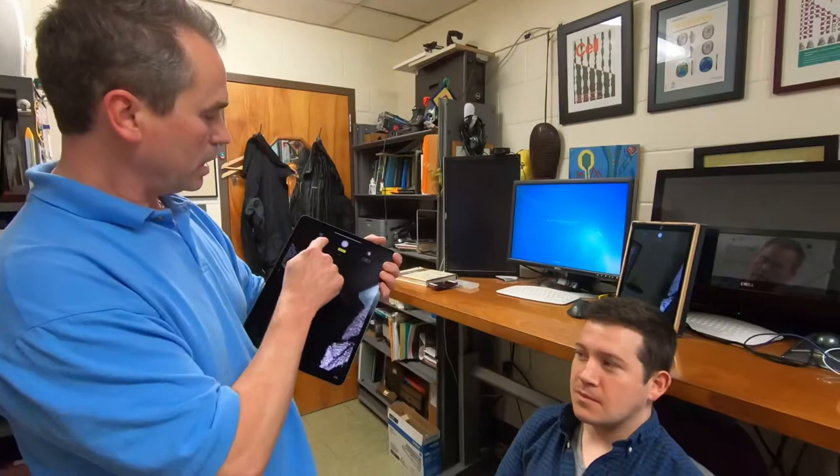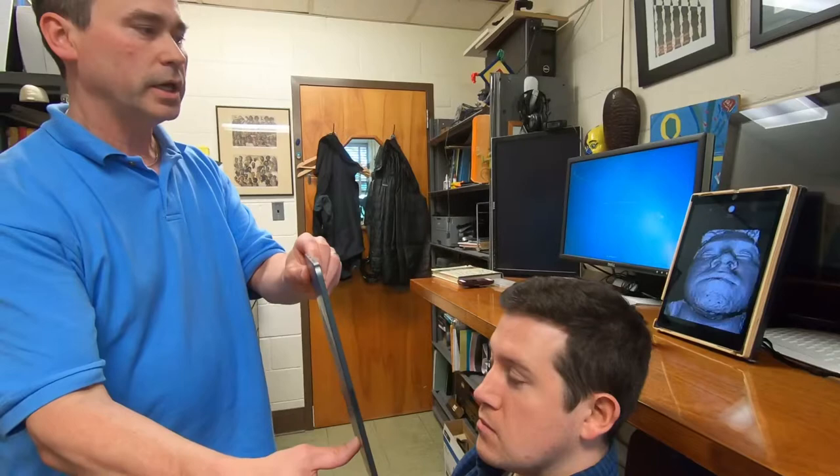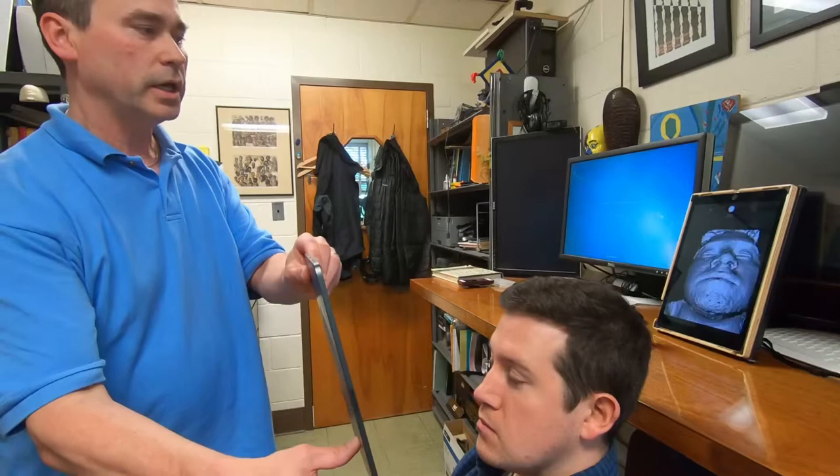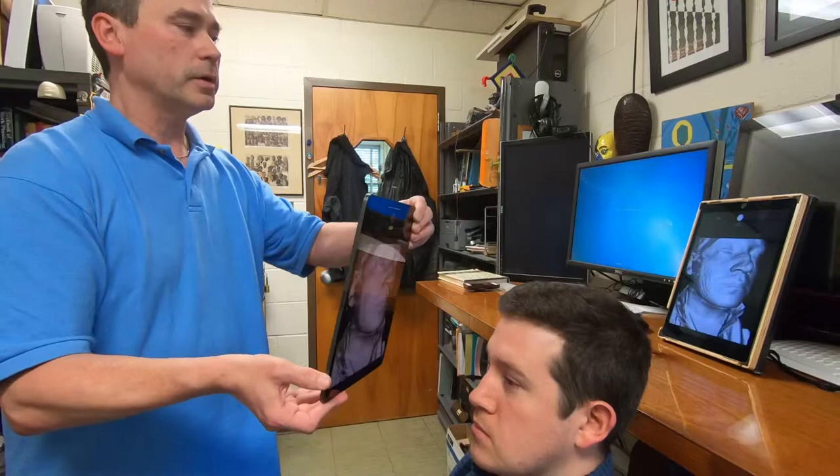So if you watch the screen or the monitor you will see how we collect the image. The closer you are, the better the resolution. You can use the volume buttons to initiate and to stop the scan. Also, the longer you image a particular part of the face, the higher resolution you get from the image.